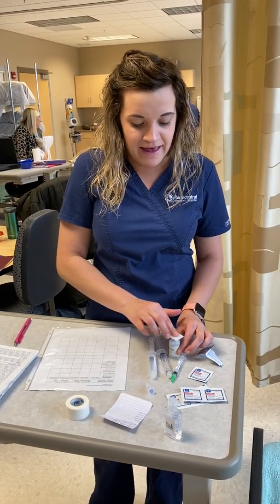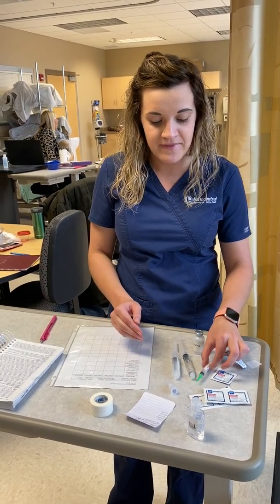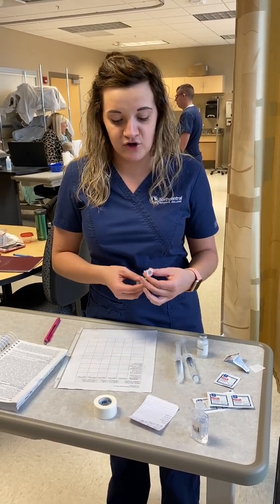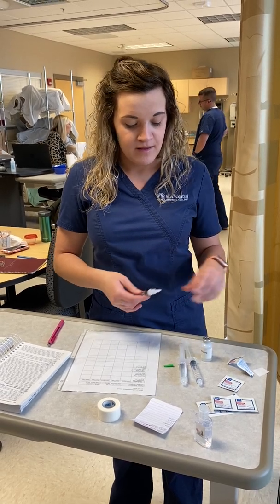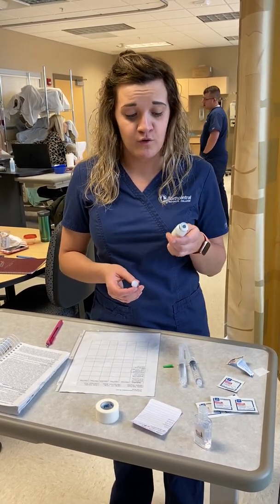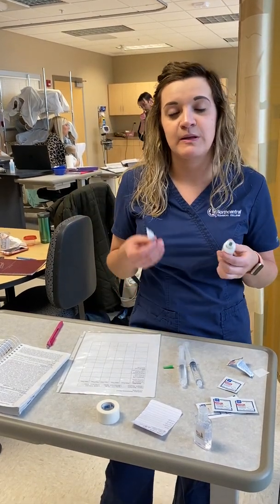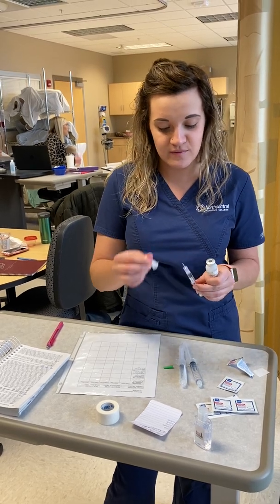So after doing my math, I'm going to let that dry. He needs to get 0.5 mLs to equal that 1 milligram IV push, because I have hydromorphone 1 mL per 2 milligrams, so doing my math, I have 0.5 mLs for the 1 milligram that I need to give. So I'm just going to go ahead and get this ready.